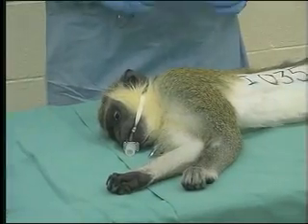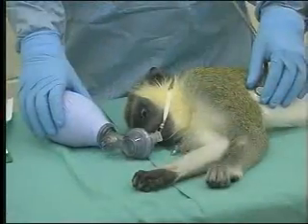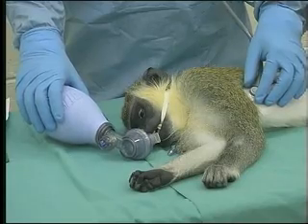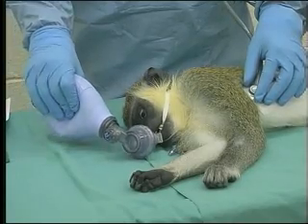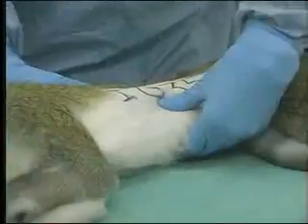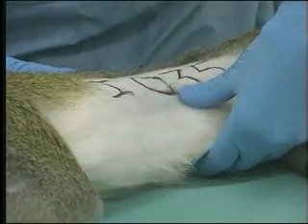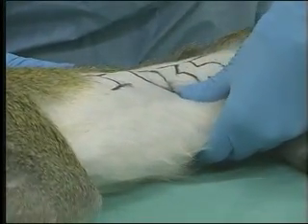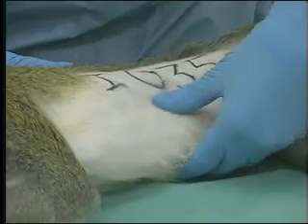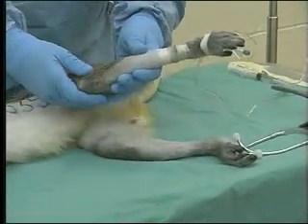Proceed down to the thorax and listen to the heart and lungs. It's important to use the Ambu bag for this procedure and note the pulmonary resistance prior to giving the simulant. Work your way down to the abdomen and assess the patient's muscle tone, abdominal tone, and extend and flex the rear legs and assess muscle rigidity.